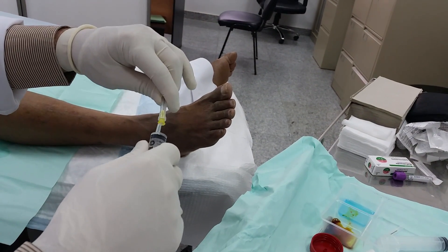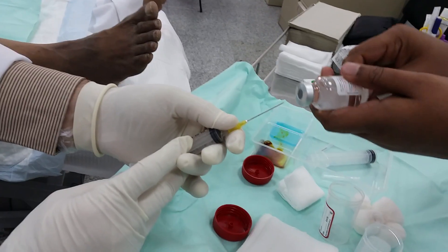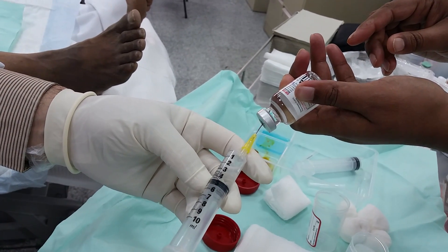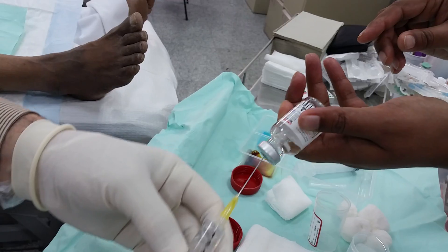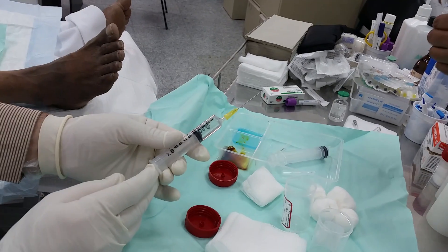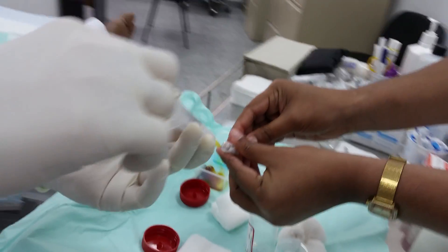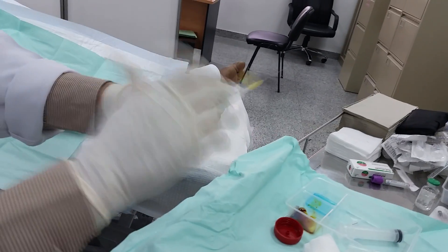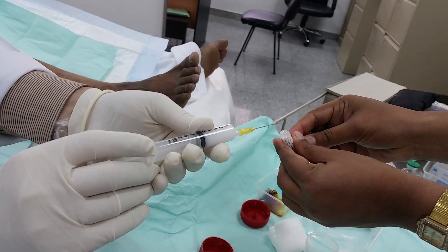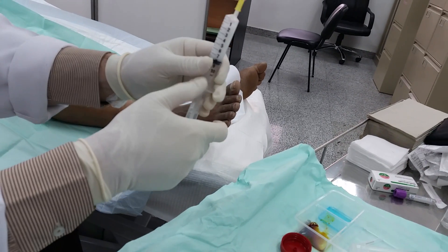I will do aspiration for the medicine. I will use 5cc bupivacaine 0.5% and 2cc Kenalog which is 80 milligrams. Our medication is ready — needle in the syringe.